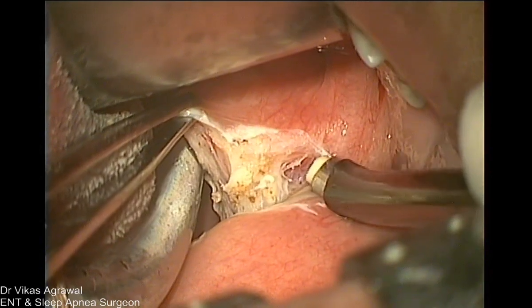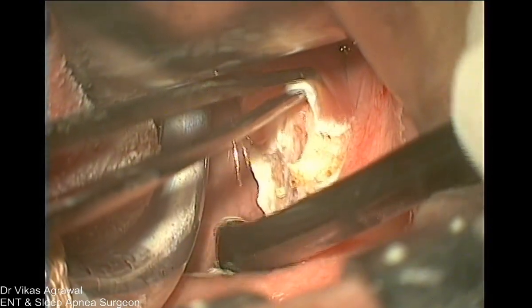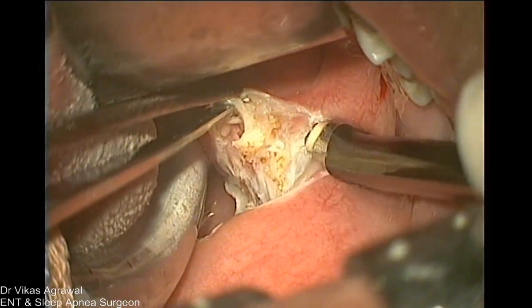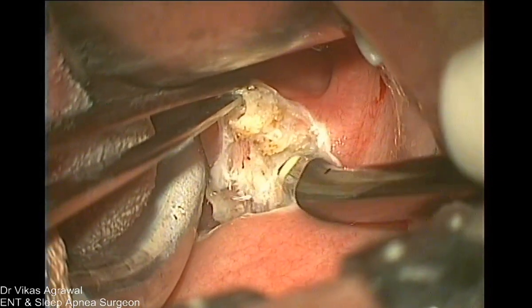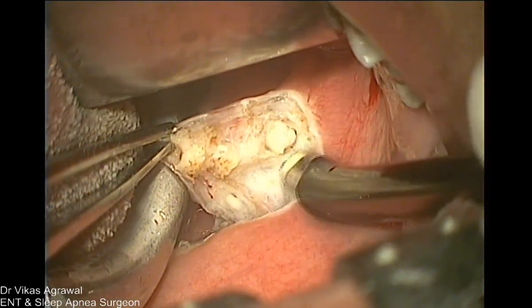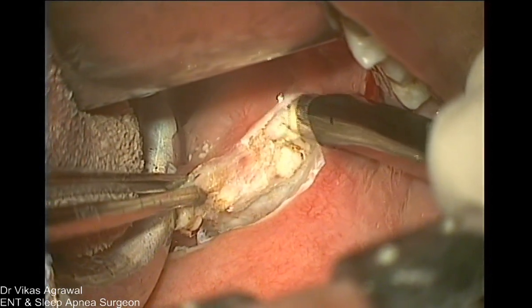Now can you see this? This is the lateral part of the tonsil. Right. I am already lateral to the tonsil, and this is the posterior pillar. Can you see that? Yeah. Now this is the part of the supratonsillar pad of fat which I have removed and entered the tonsil. As I go behind, here I am just going laterally first. Do a routine. See how much is the lateral component of the tonsil here. So you have to remove this because this is in the upper part of the tonsil.